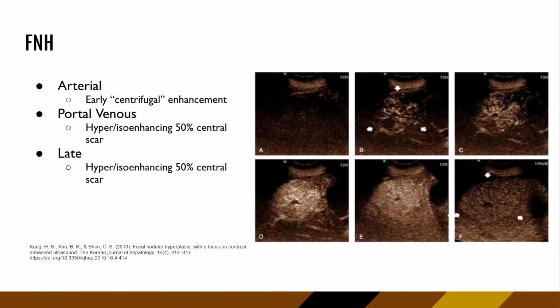Let's talk about one more kind of complex structure, and this is an FNH, or focal nodular hyperplasia. If you think back to what you know about focal nodular hyperplasia, we know that this basically has all the same components as the liver. It has the Kupffer cells, the hepatocytes, the biliary system, the portal veins, all those components are there. They're just in a disorganized way. So we end up referring to focal nodular hyperplasia as a stealth lesion because it's really hard to see on grayscale in the liver, because it's made of all the same content, right?